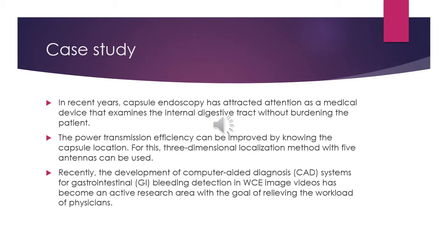In recent years, capsule endoscopy has attracted attention as a medical device that examines the internal digestive tract without burdening the patient. The power transmission efficiency can be improved by knowing the capsule location. For this, a three-dimensional localization method with 5 antennas can be used.